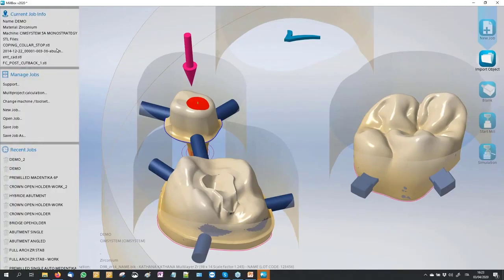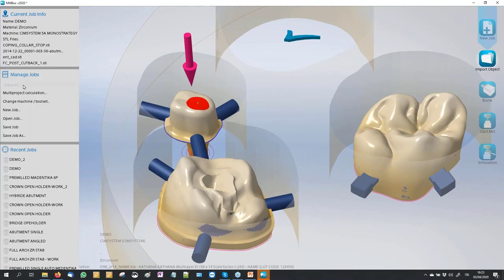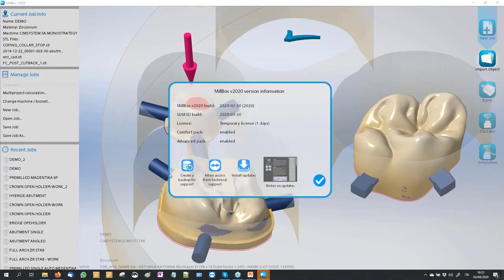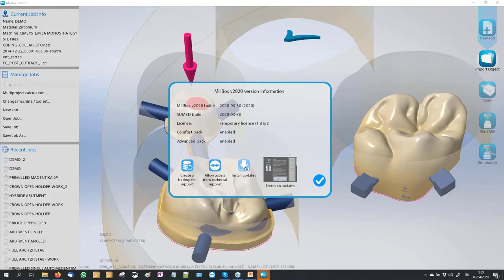The second icon shows us information about our job: the job name, the material, the name of the imported STL, and so on. In the support section you can click to create a backup of a case to send us when there is a problem. There is also an icon to start a TeamViewer session for our support to connect and manage a project, and an icon to go directly to our web page to download the latest update for your machine.